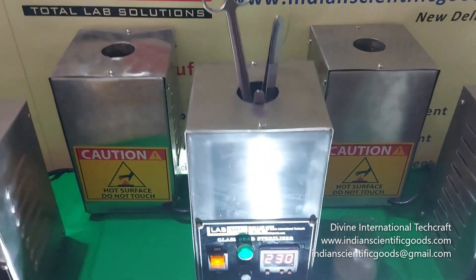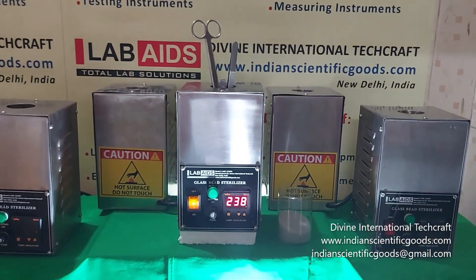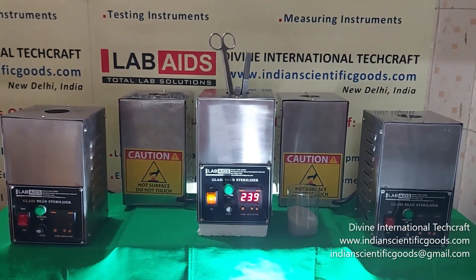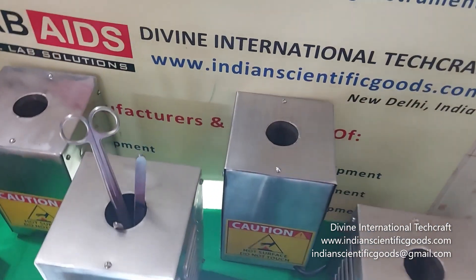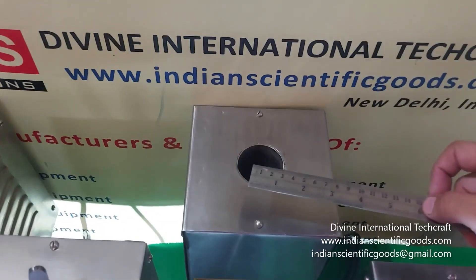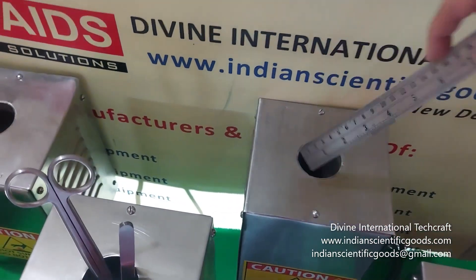Glass beads are heated to approximately 250 degrees centigrade for a defined period of time. These sterilizers are made of stainless steel and fitted with a crucible of dimension 50 mm diameter and 150 mm depth.